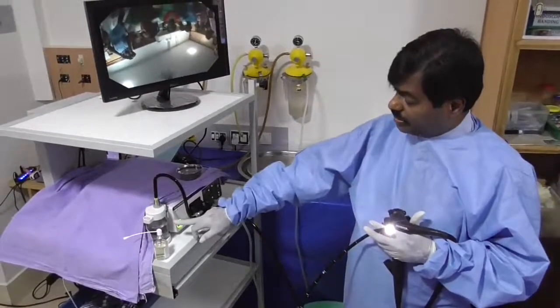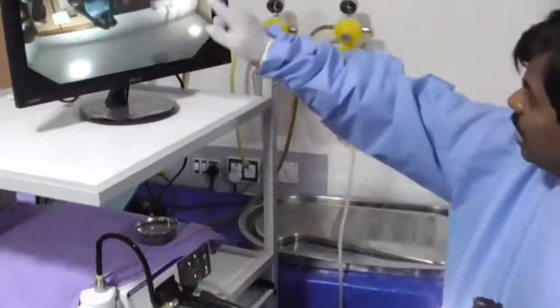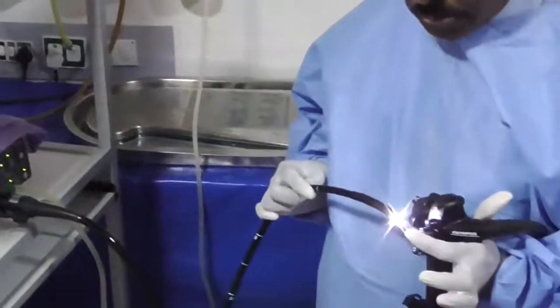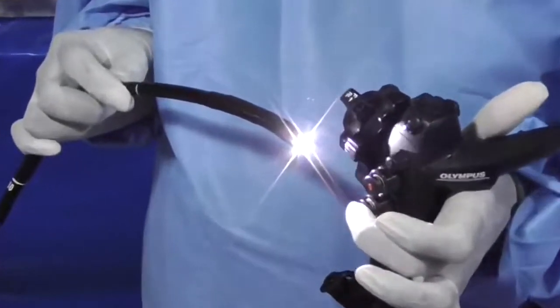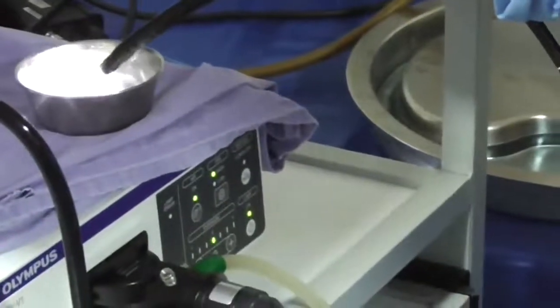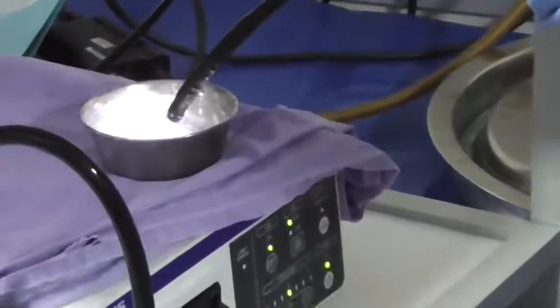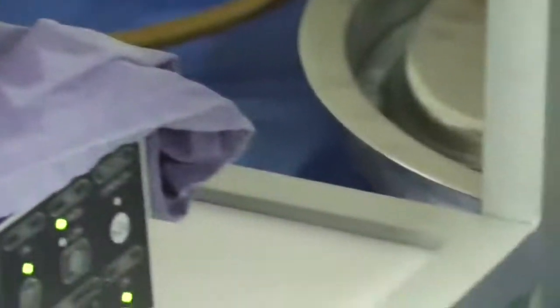First, I'll check there is enough water in the bottle attached to the video processor. The suction effect is ready and I can see an image on the monitor. The three important functions concern the buttons: the superior button is for suction, and the inferior button is a dual function — a light touch insufflates air to distend the esophagus and stomach, while pressing hard instils water to clean the lens. I'm checking the suction under water to confirm the instrument is working.